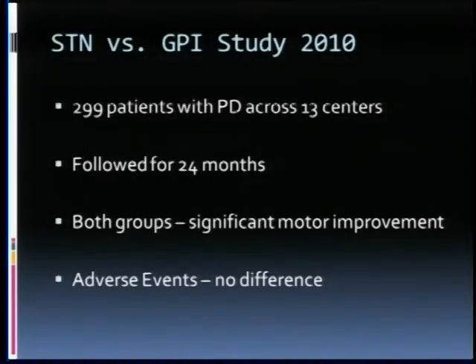If you look at adverse events, bleeds in the brain or infection or things that are concerning with this surgery, there was no statistical difference between either target as far as safety or which site was safer or less likely to cause an adverse event in a patient. They were both found to be equal. And of the adverse events that were documented, 99% of those resolved by 24 months post-op. So in the things that were reported in both groups, fortunately there was almost complete resolution of those adverse events.